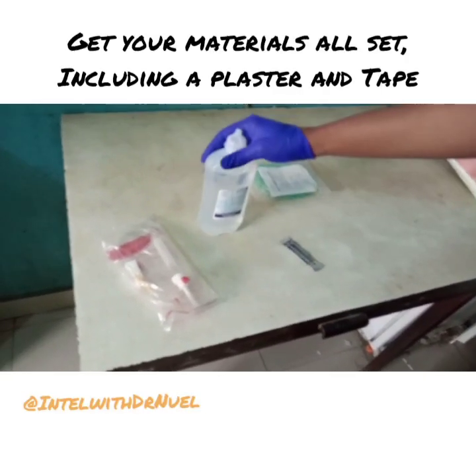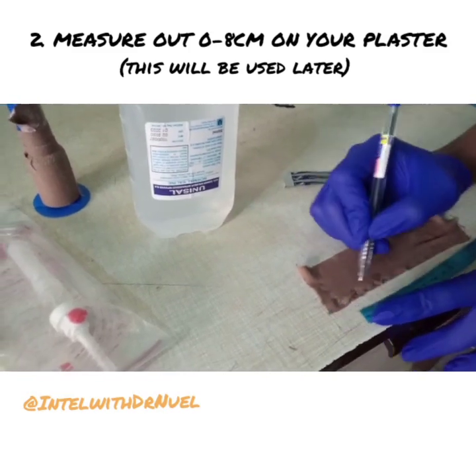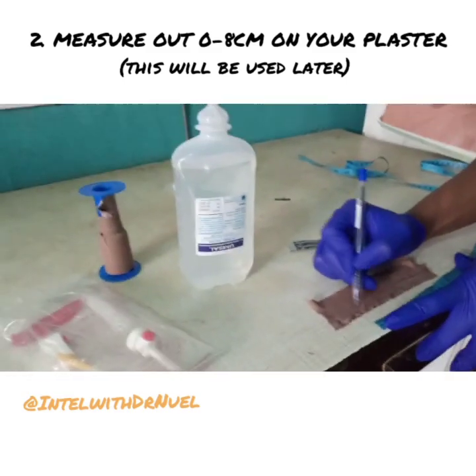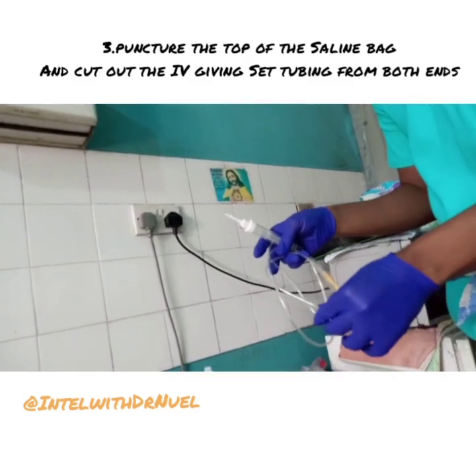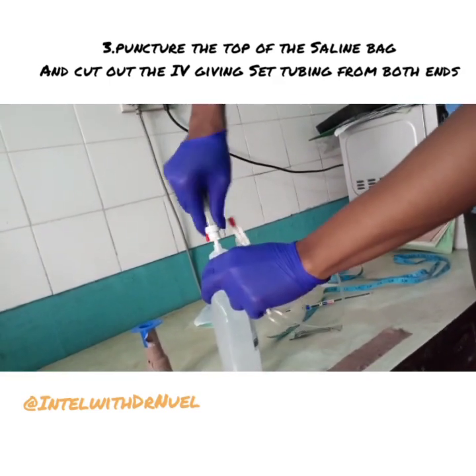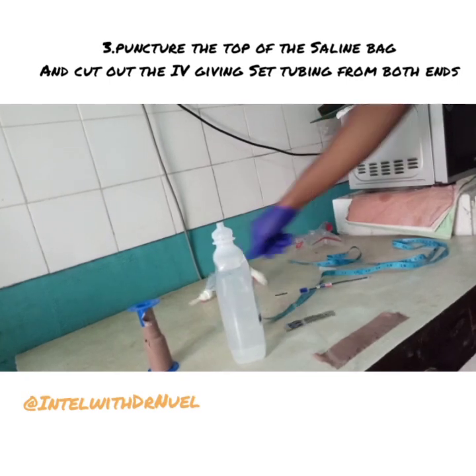Your surgical blades, the bag of normal saline, and nasal prongs. So the main thing we need here is the wire. We want to puncture the top with this as well first, okay? So I'm just going to go ahead and puncture this. So that's open. Then this wire, we need as much of it as we can get.